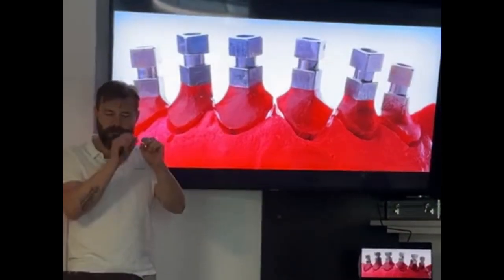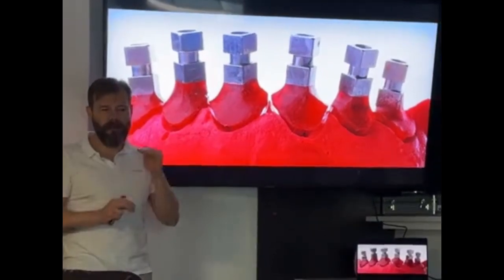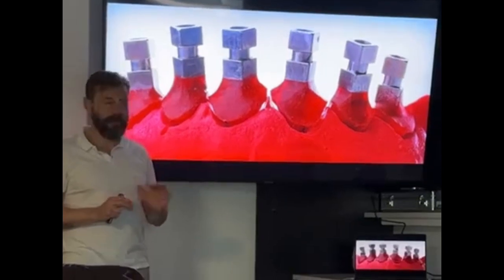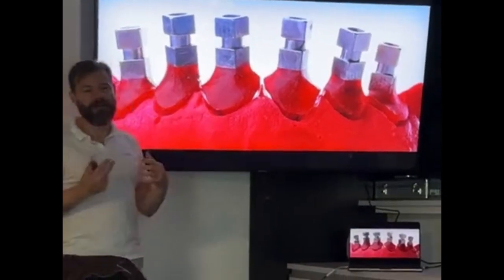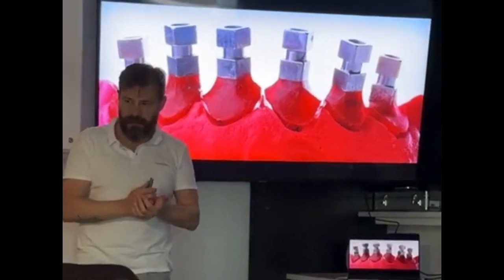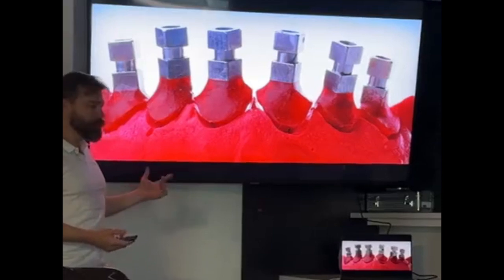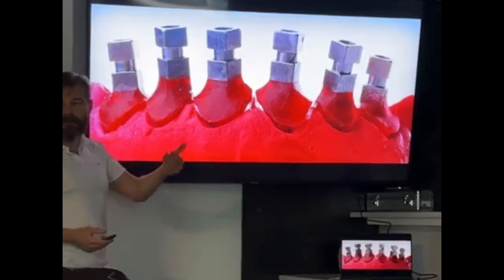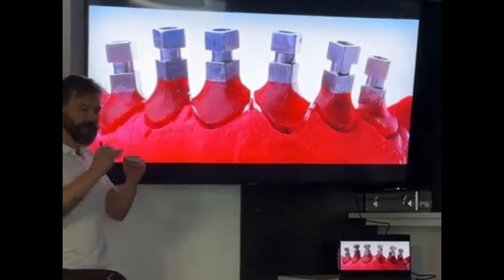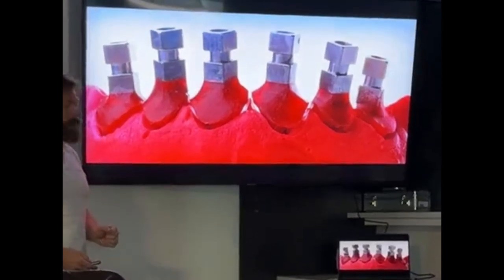Most patients with this amount of compression do not even complain about it. If it's more than that, or if your patient is a little more sensitive, you need to give anesthesia to the patient. Okay, nice. And these impression posts also, at the end of the conditioning stage, if the gingiva does not change, you can use for the final impression in an analogical workflow.